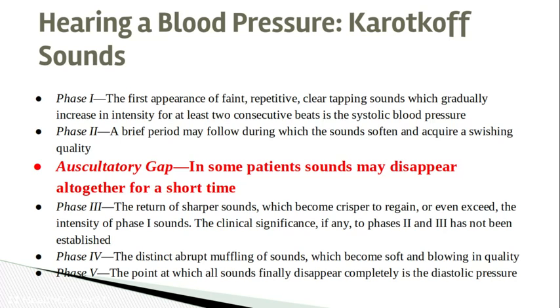If you're not aware of that, and you lose the sounds and let out the cuff right away, you might have missed the accurate blood pressure. Again, this is sometimes, so this is not in all patients.